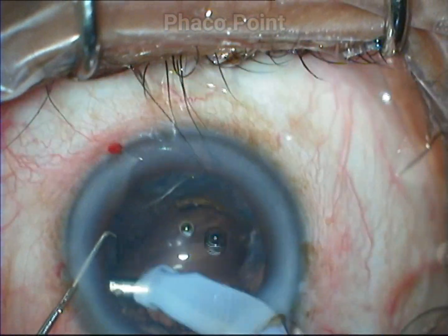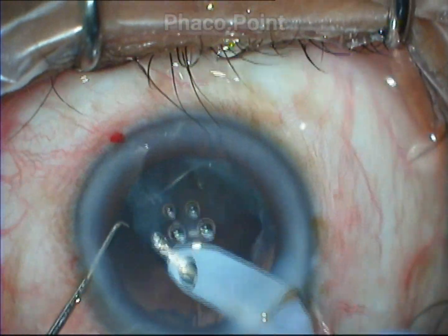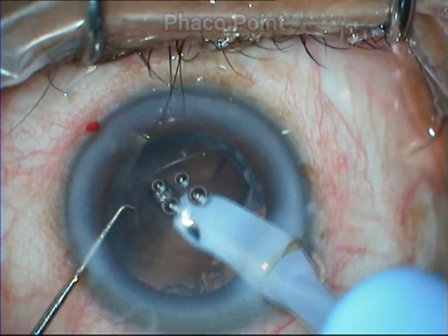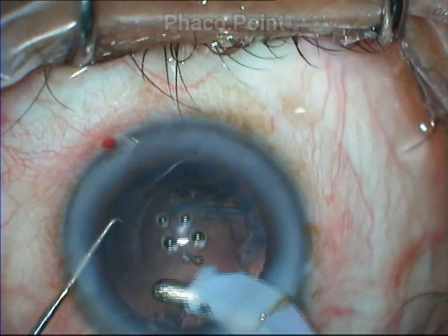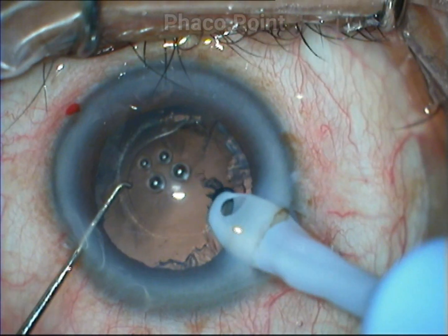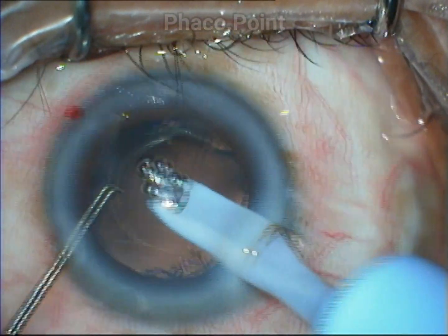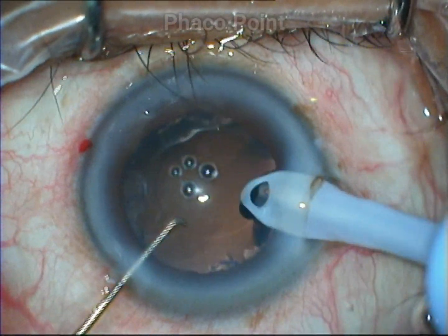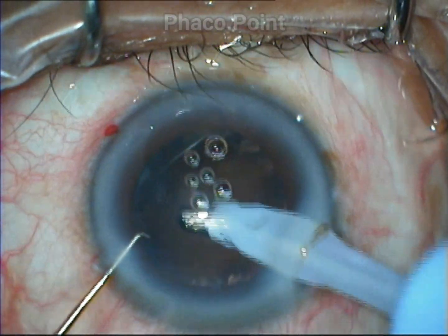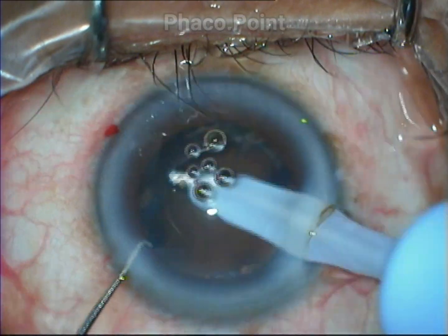The net result of this blunder is that at the end of nucleus disassembly, I am left with a very thick sheet and shell of the epinucleus. The problem with this epinucleus shell is that while you try to grasp the edges in order to gain hold and to pry it off the posterior capsule, you will only end up trimming the edges and leaving behind the thick plate.